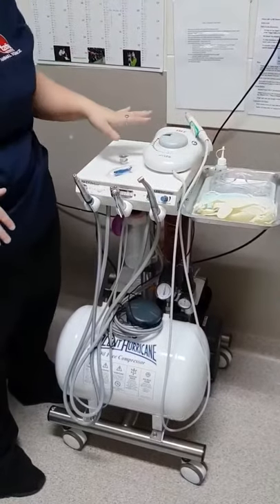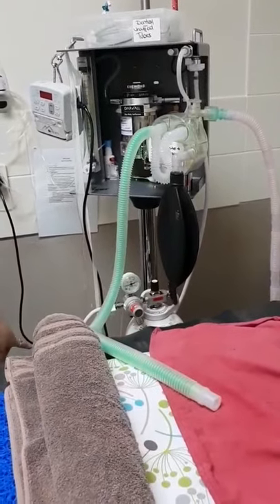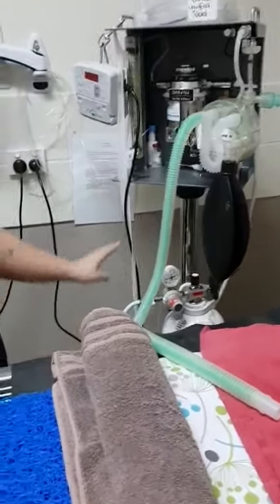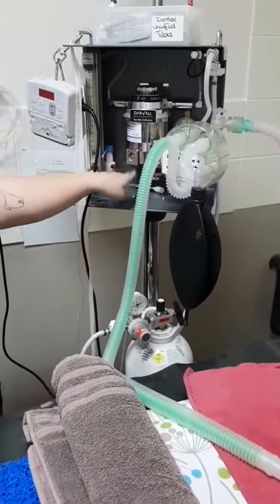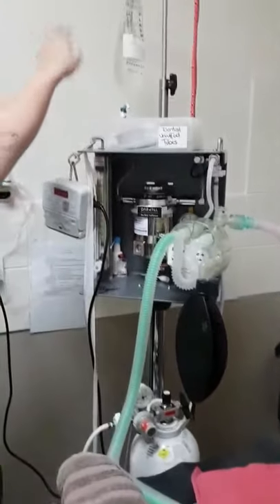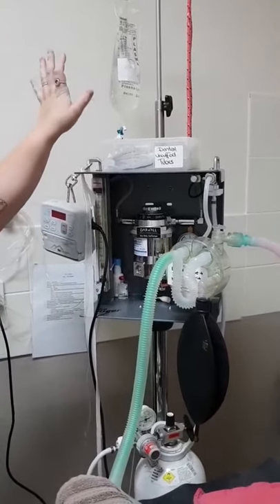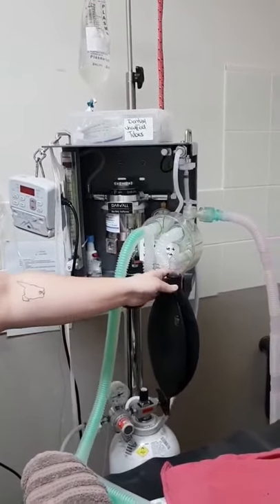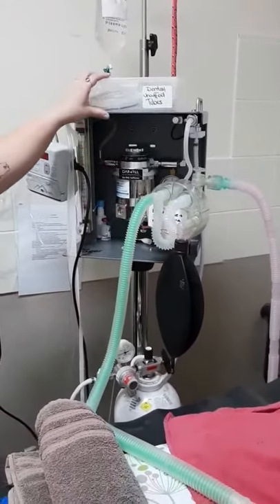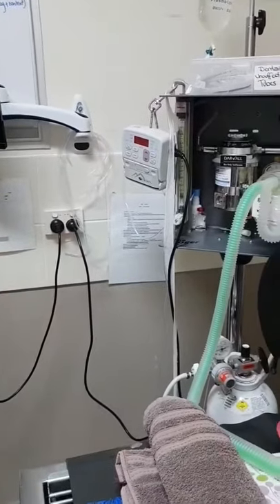We also wipe down the entire machine, making sure no blood or anything is on there. For our anaesthetic machine, we will change out our scavenger before and after each dental. We will check our oxygen levels and also check our isoflurane levels to make sure it is full for each dental. We will also double-check our fluid bags to see if they need to be replaced. Everything is wiped down, circuits are washed out, and checked for leak tests. We also have extra cuffs and ties that are washed and cleaned between each use.